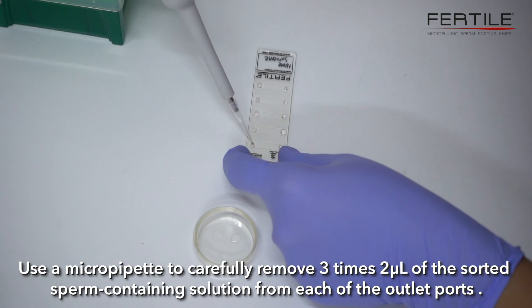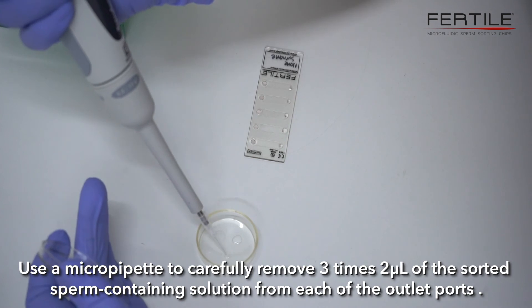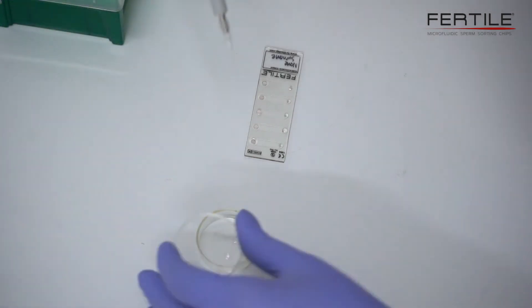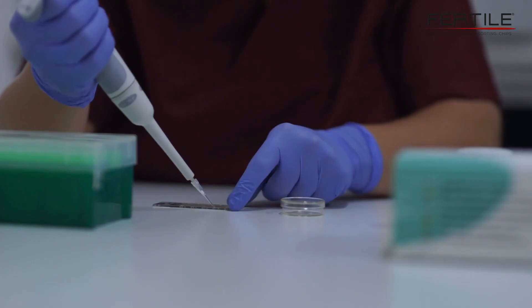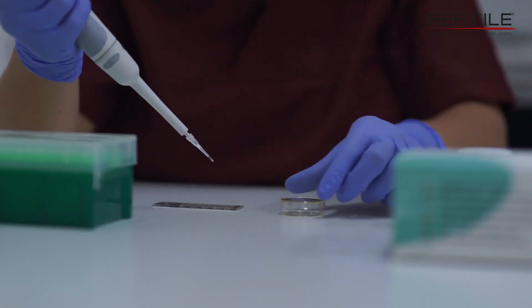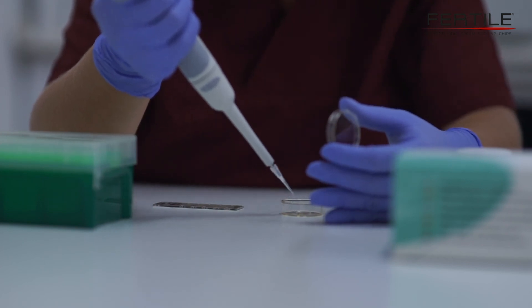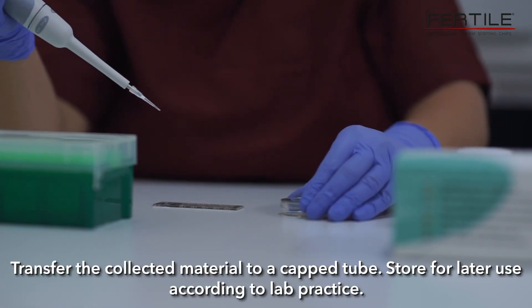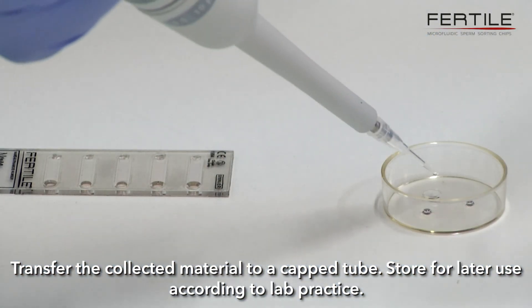Use a micropipette to carefully remove 3 times 2 microliters of the sorted sperm-containing solution from each of the outlet ports. Transfer the collected material to a capped tube. Store for later use according to lab practice.